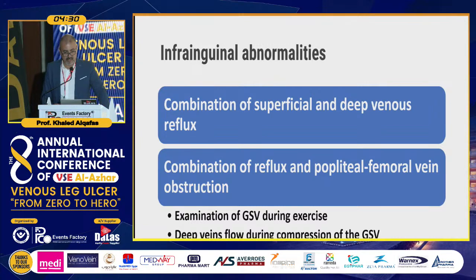or examination of the deep veins after compression on the great saphenous vein. If the flow within the deep veins increases, denoting that there is a refluxing type and there is no obstruction. So we have to surely differentiate between these two pathologies for patient treatment sake.